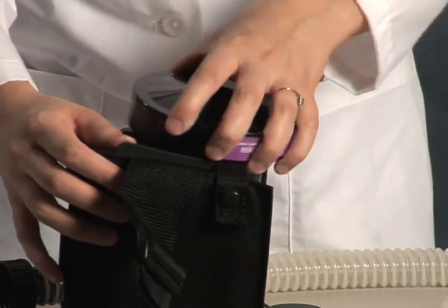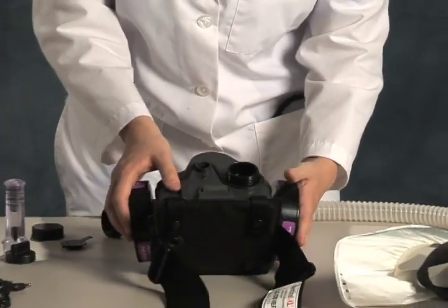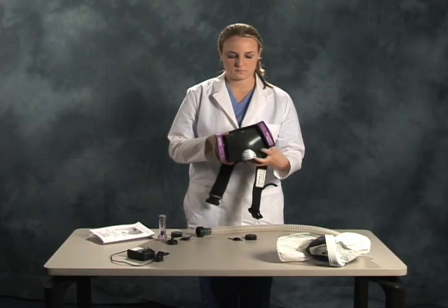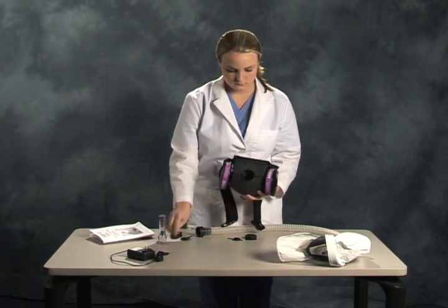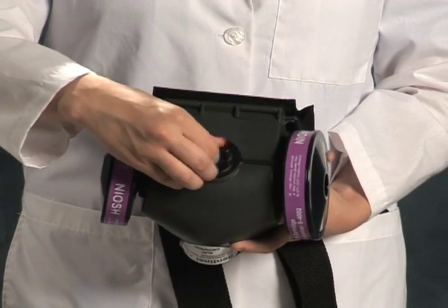The blower only requires two filters for the HEPA configuration. However, there are three threaded ports available. For this reason, a plug is provided for insertion into the third filter port. Insert the plug, or confirm that one has already been pre-inserted.